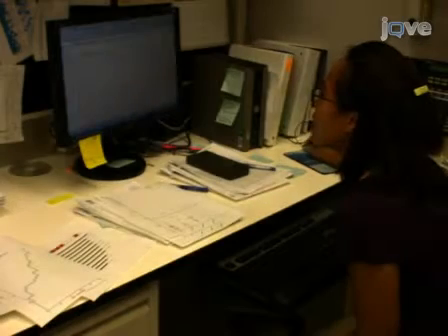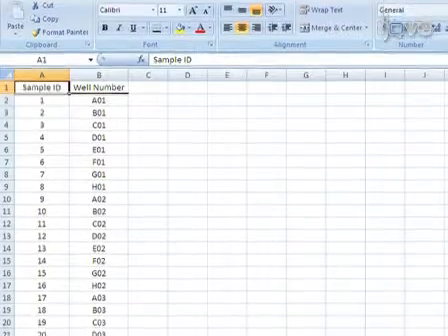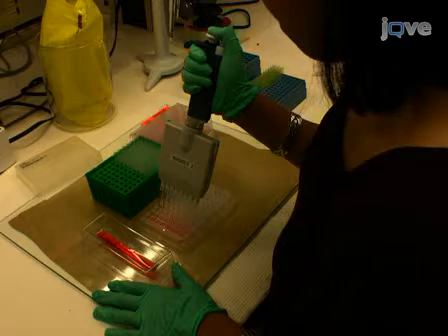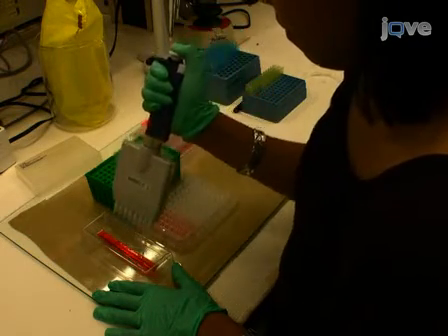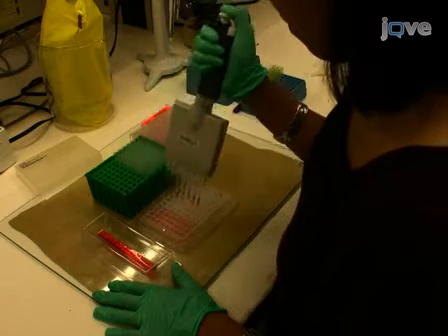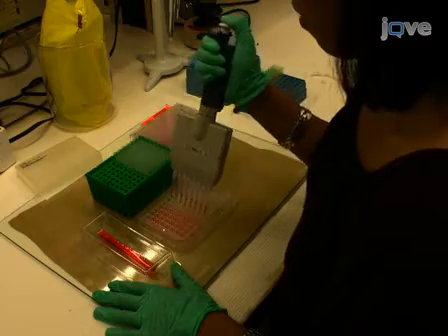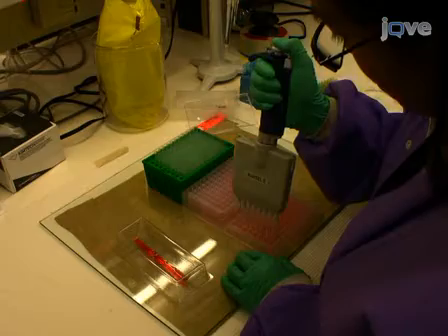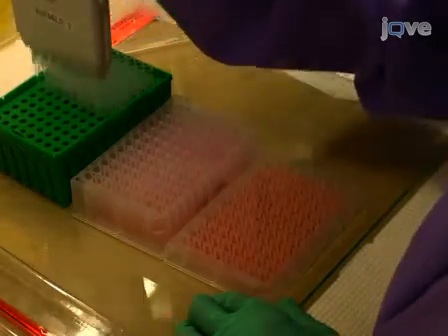Prior to running the LIPS assay, organize a spreadsheet containing the sample identification numbers and their associated wells on the master plate. Polypropylene 96 shallow-well microtiter plates are used as working plates to test sera. In the first step, add 40 µL of buffer A to each well of the 96-well plate. Next, take 10 µL of diluted sera from the master plate and add it directly to each well of the working plate using an 8-channel micropipette.